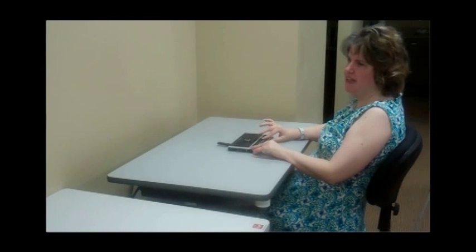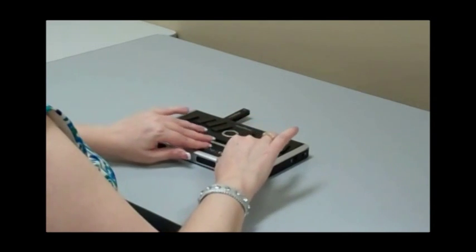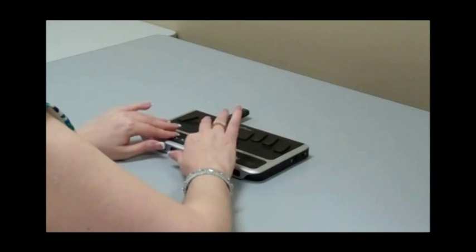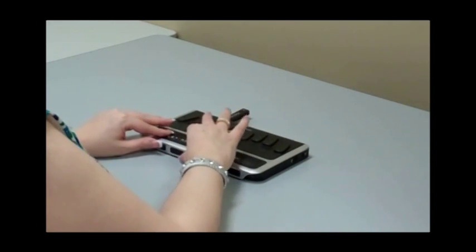So if I want to type in this document, if I needed to edit anything, I have to type in a certain type of Braille. And so if I were doing this in the studio, maybe I would be looking at the words and just kind of singing along.